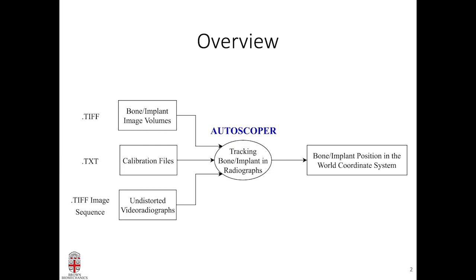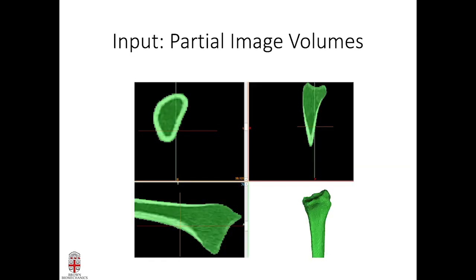The output is the bone or implant position and orientation in space. One input is a partial CT volume — here you see the model of the radius. We need the density-based information of the radius; the edges appear because bone density is higher, giving higher intensity, while the inside has less value. Autoscoper uses a ray casting approach to create the digital reconstructed radiograph of the bones.